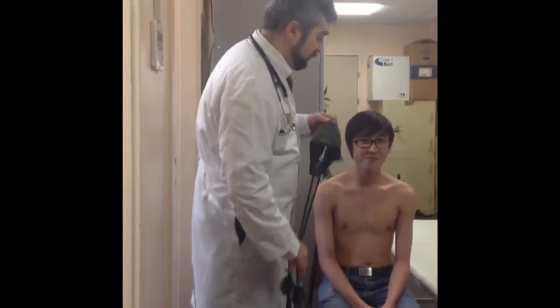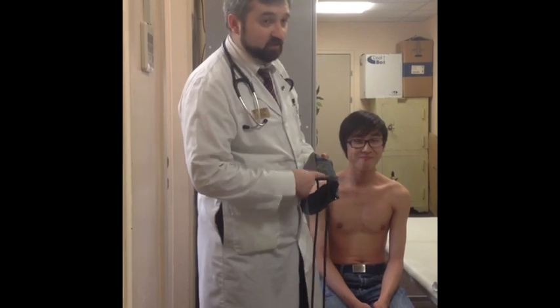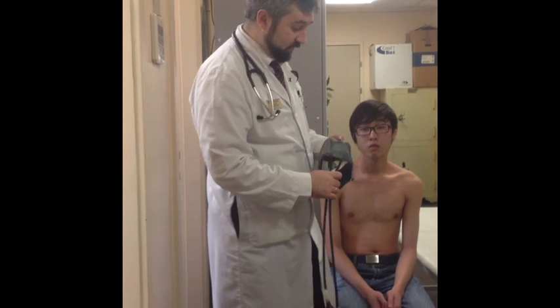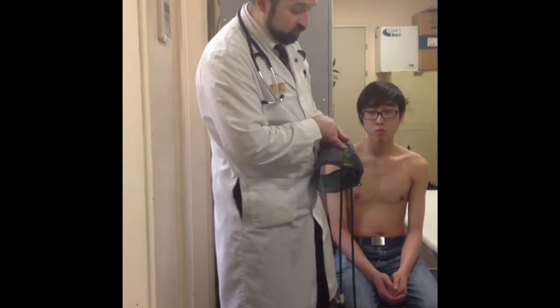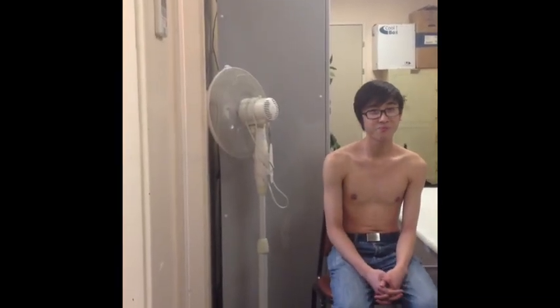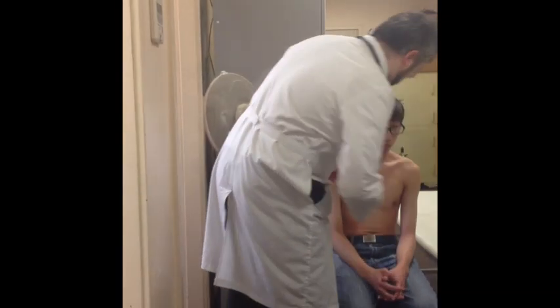We choose the arm with the highest pressure, or if the pressure is the same, we choose any arm. There is a mark — the label 'artery' — which must be placed over the brachial artery. If there is no mark, the tubes must be over the brachial artery. The cuff size is 25 to 36 centimeters, so you have to measure the arm.